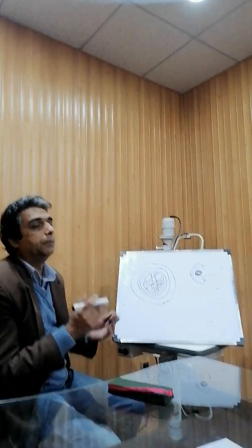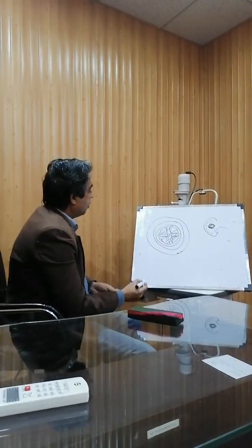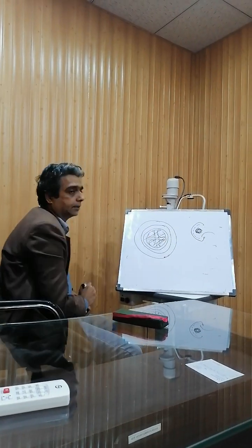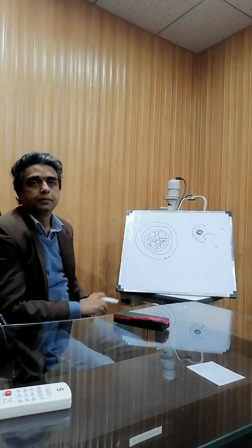Now in the phaco machine you will go to the lower power, which is called memory 2. That is, the power of the phaco is now decreased, and now you will one by one eat away all these four parts of the nucleus.